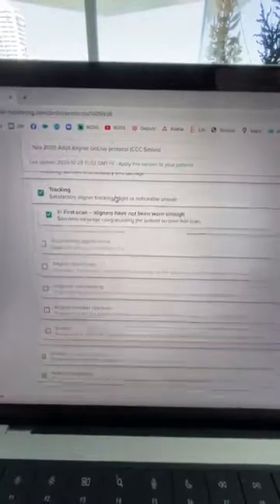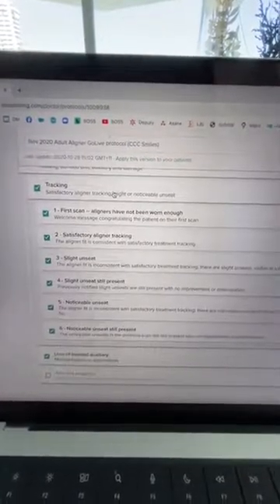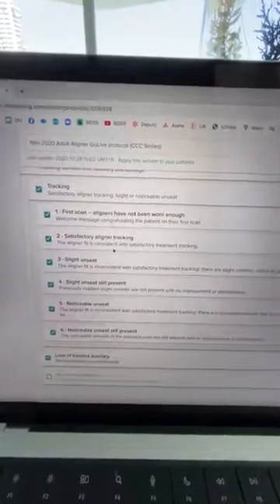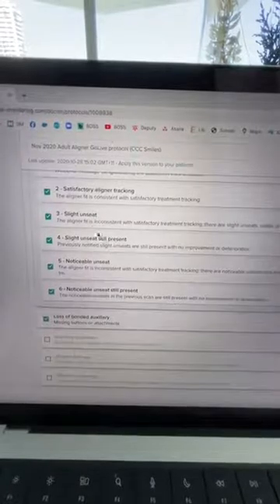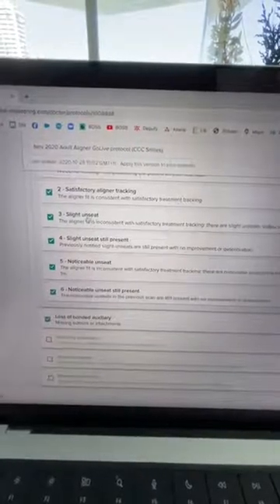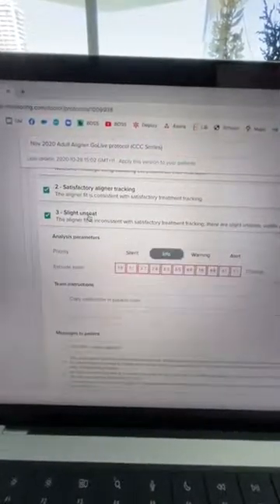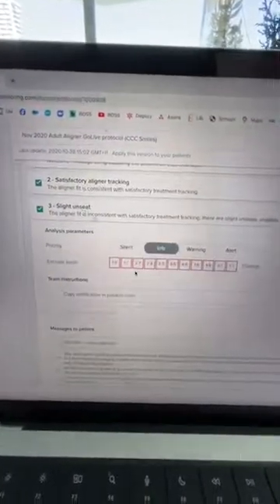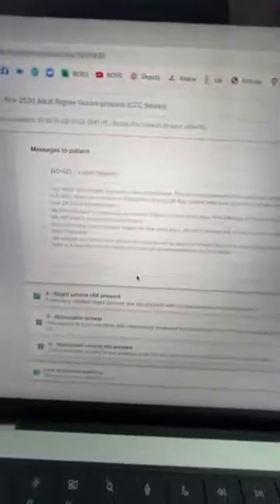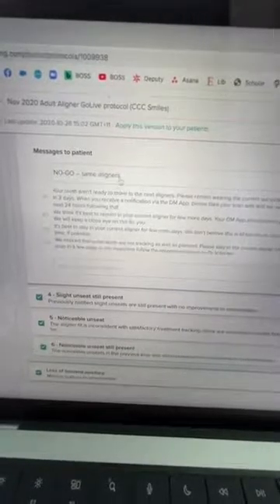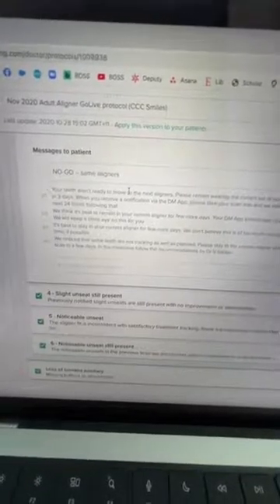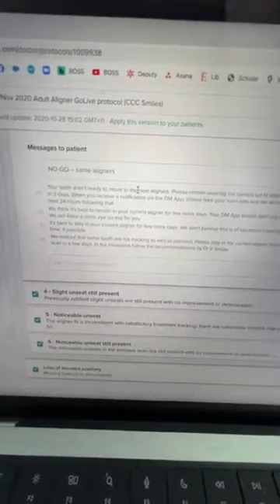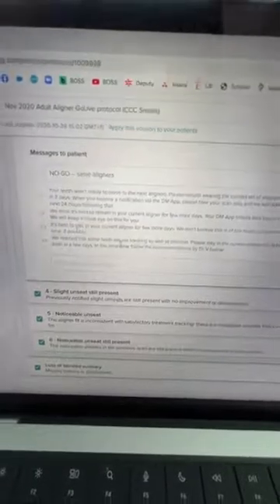Obviously we're tracking aligners, so I'm more interested in how well the aligners are tracking, meaning how well they fit. These are all the different ways you can track. What if there's a slight unseat? My protocol here says if there's a slight unseat, please tell the patient to not change their aligners. They're going to stay on the same aligner and you're going to give them these different messages.